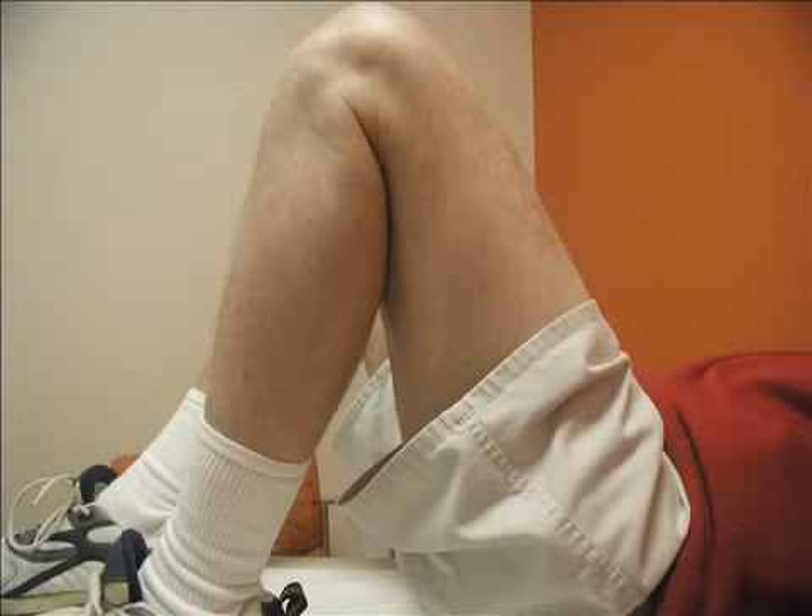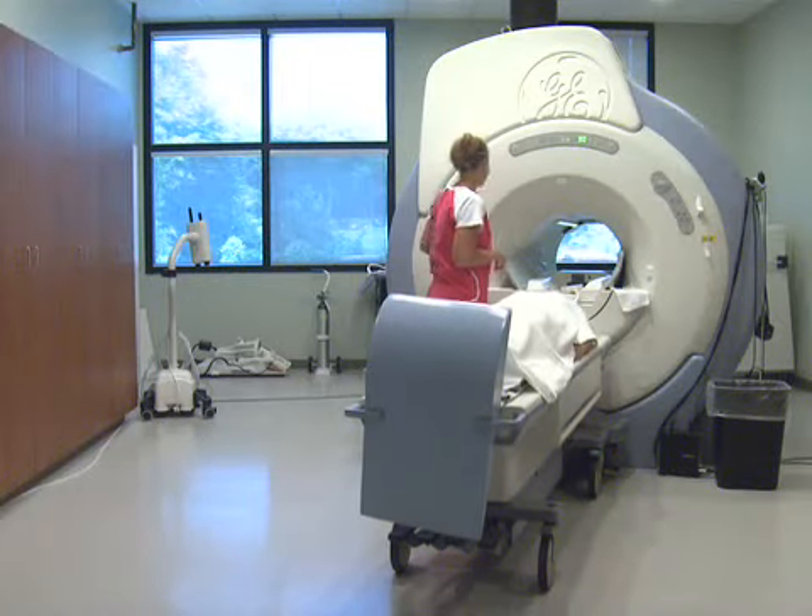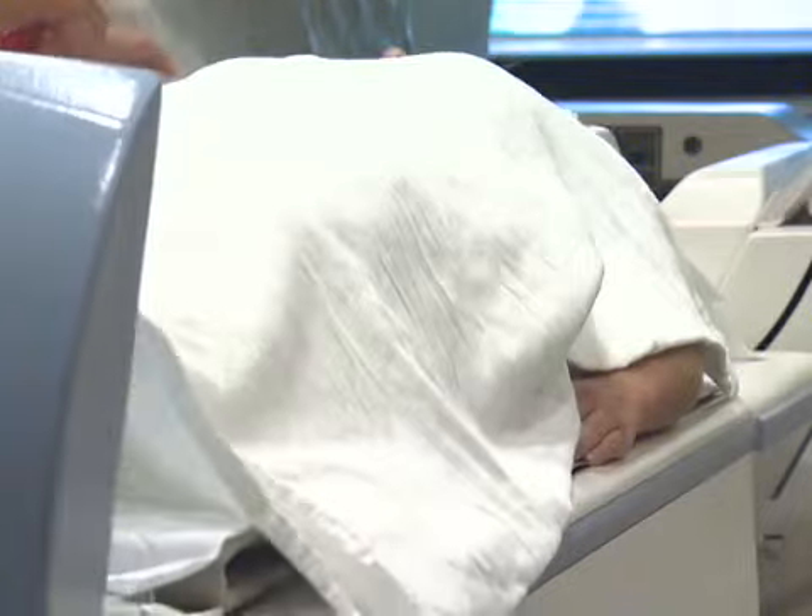Over the past two decades, several advances have occurred which have allowed us to better treat these injuries with this less invasive procedure. Your surgeon has carefully examined your knee prior to surgery. Furthermore, you most likely have had a set of x-rays and possibly an MRI has helped your surgeon to confirm a diagnosis of an injury requiring knee surgery.